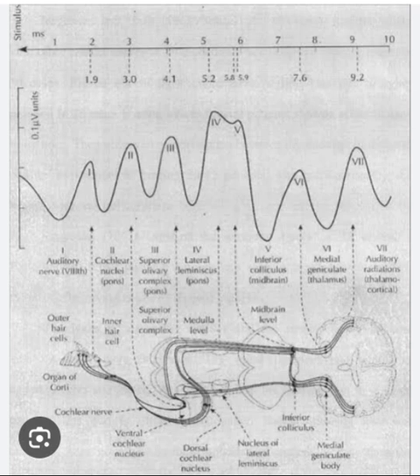Waveforms. The BERA waveform consists of several distinct components, typically labeled as waves I, 2, 3, IV, and V. Waves VI and VII have little clinical utility, and therefore, the primary focus is on waves I through V. Each wave represents the synchronized firing of specific groups of neurons along the auditory pathway, from the cochlea to the auditory cortex. These waves provide valuable information about the integrity and functioning of the different structures involved in hearing.